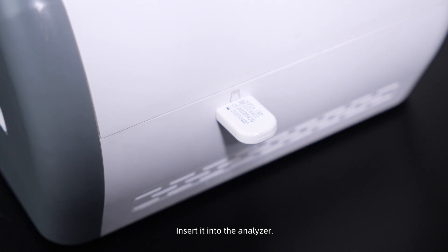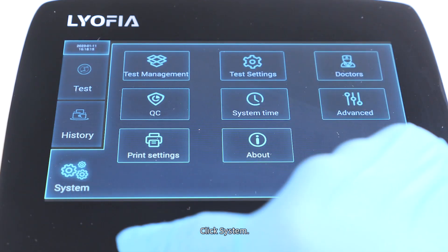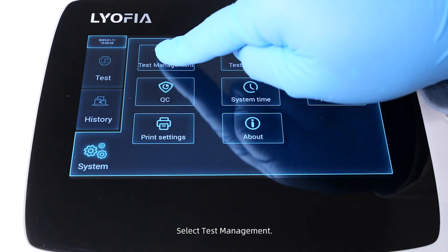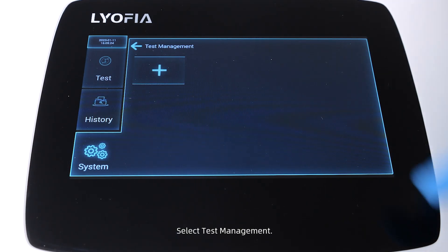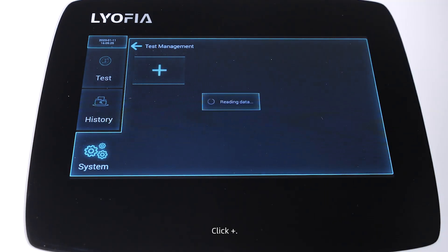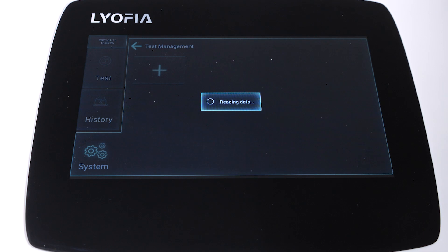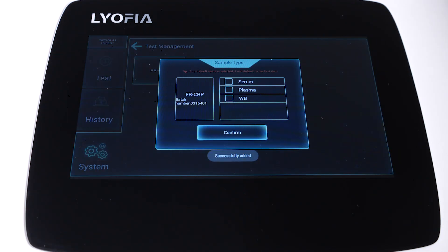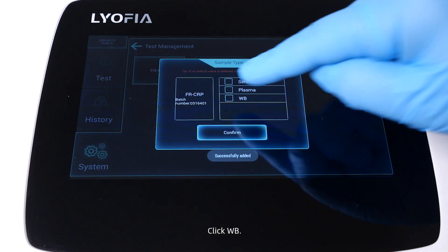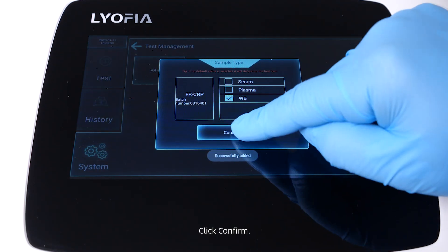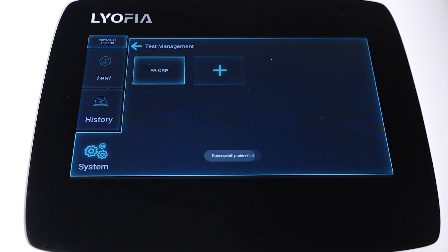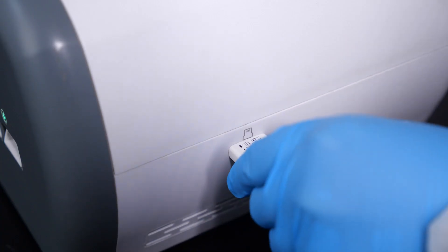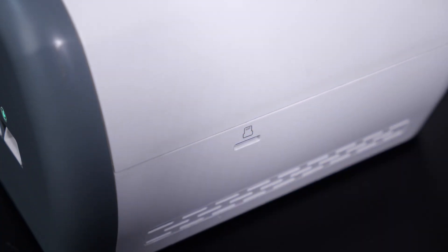Click System, select Test Management, click Plus, click WB, click Confirm. The test item is added. Remove it and take out the test cassette.